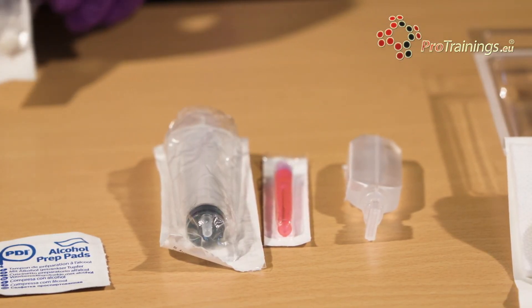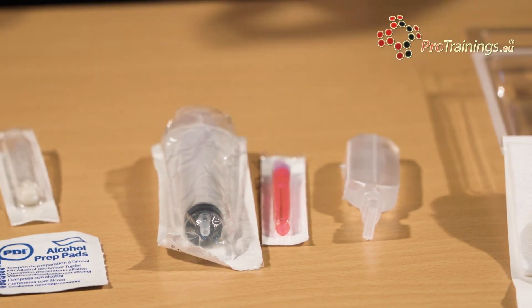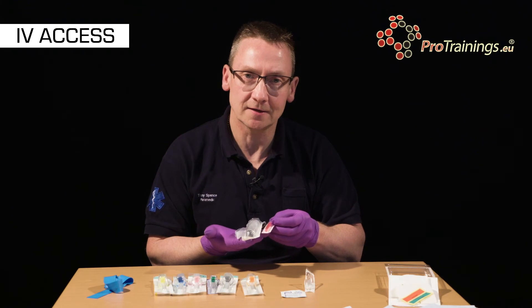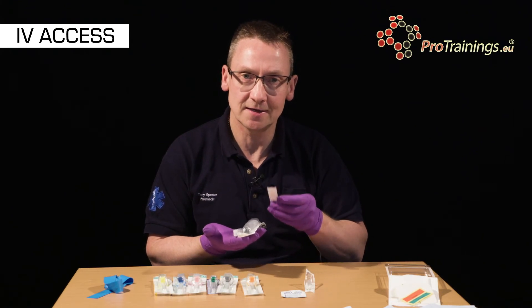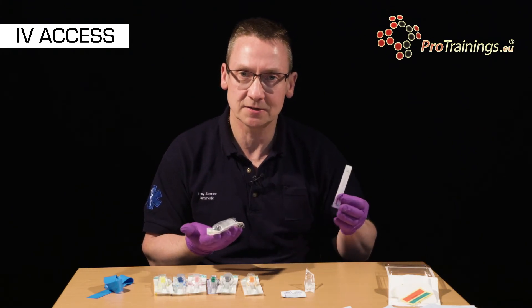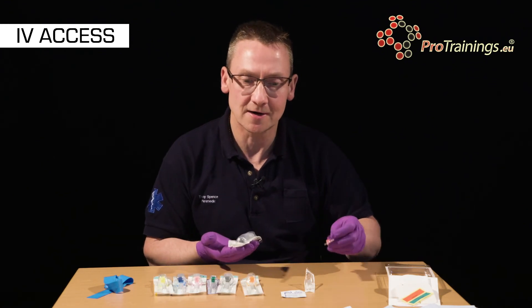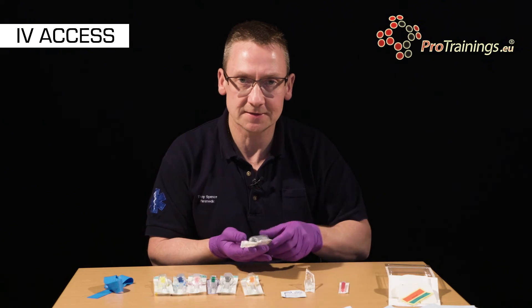We need to make sure that the cannula is patent, so we would draw up some normal saline into a syringe so that we could flush the cannula and test that it is patent, as a patient would often feel the cool fluid flowing up the inside of their arm. This confirms that it's in place.